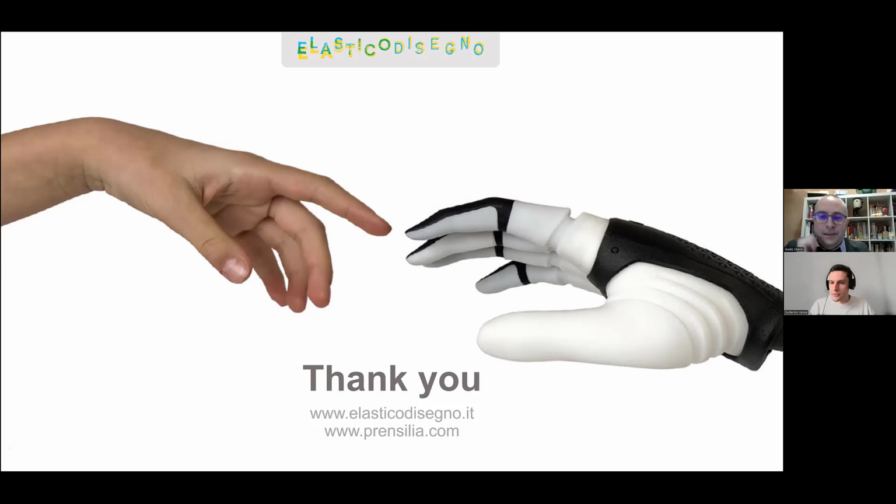Rob is saying again, from the initial working design launch, what percentage of change to the design have you made to date? You were explaining it a bit, but most of the design is still there. It's still the same. If you look at the hand that's on the screen, or for example this, which is one of the latest iterations, which is already in full color, if you see my webcam. So I can say that 90% of the original design is still there.